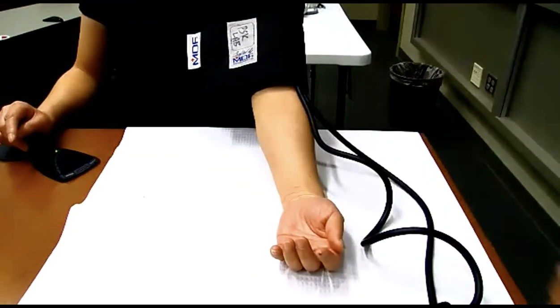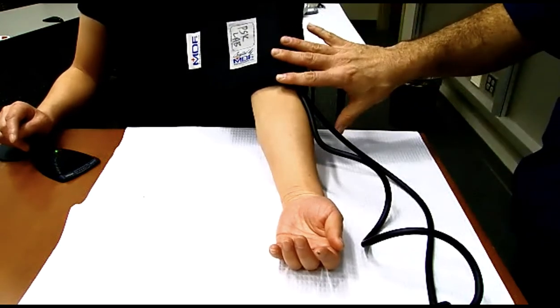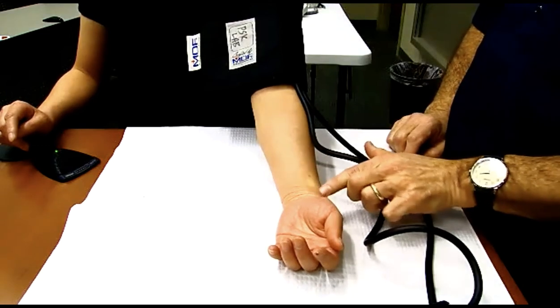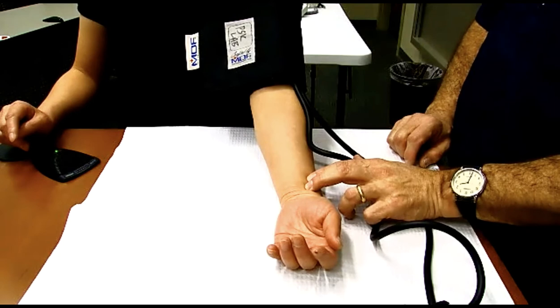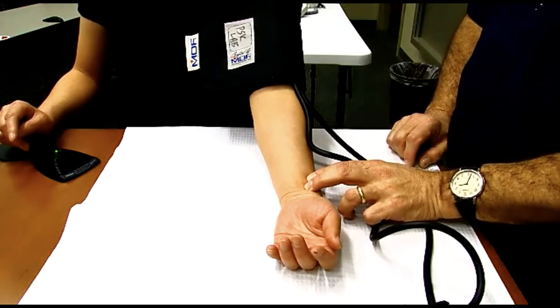Obtain the pulse rate. So now that I've put the cuff on, I'm ready, not to take the blood pressure yet. I'm going to do the pulse. So this is where I'm going to use my middle finger. There's the thumb. There's the bend in the wrist. So I would come right over here and push down on it. And I think you can feel it today. That's pretty good. How long? I didn't talk about this. How long do you count?